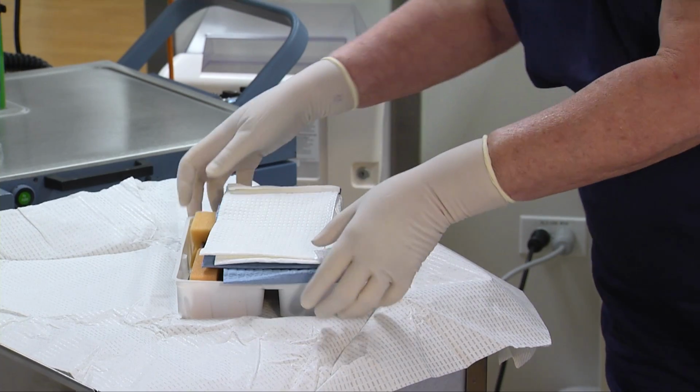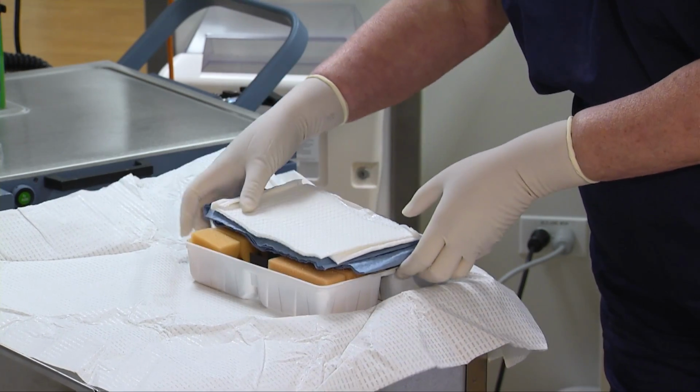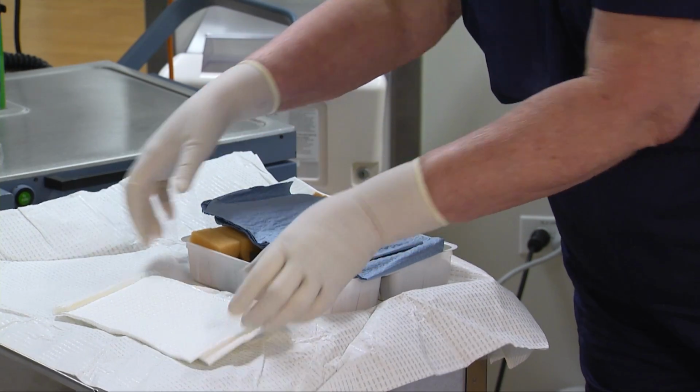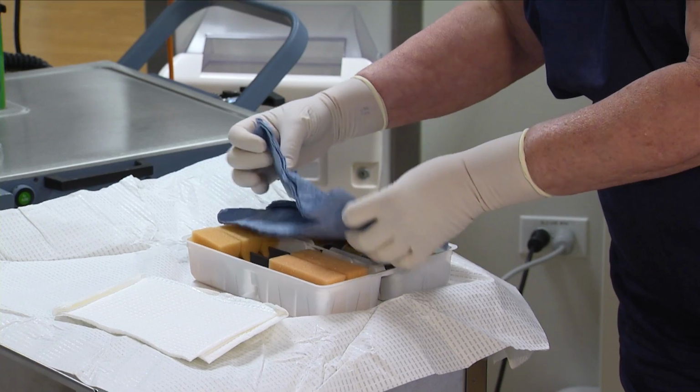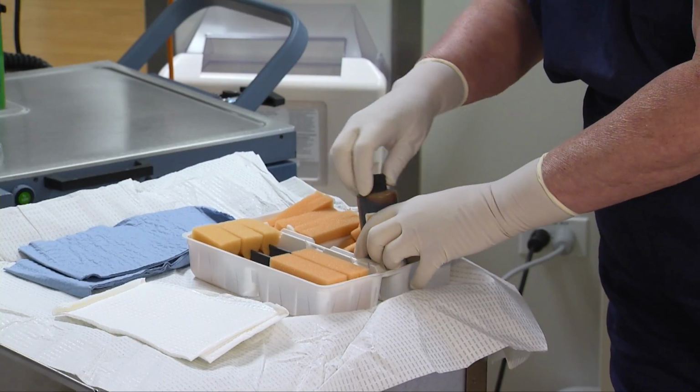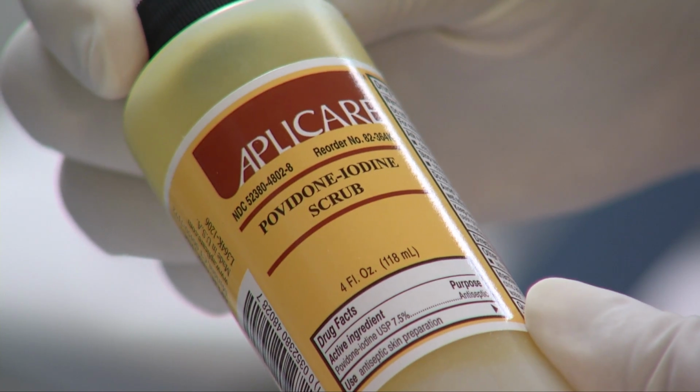Organize the supplies within the sterile field. The towels with the impervious barrier are used for draping, and the absorbent towels will be used for drying. Set aside the towels within the sterile area of the wrapper with the drape towels on top. Identify and apply the solutions to the appropriate applicators.